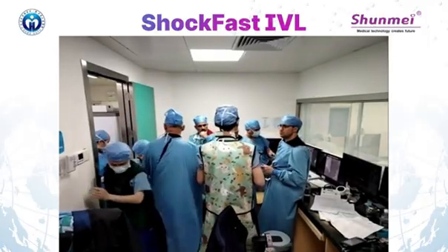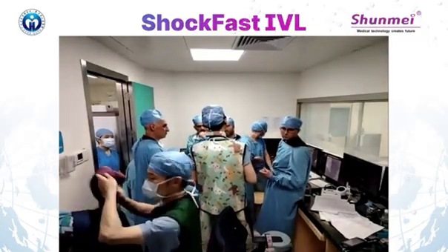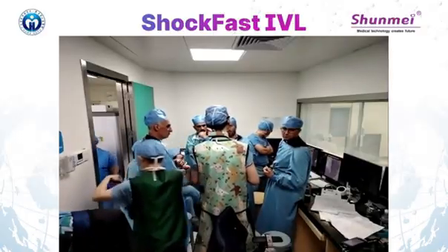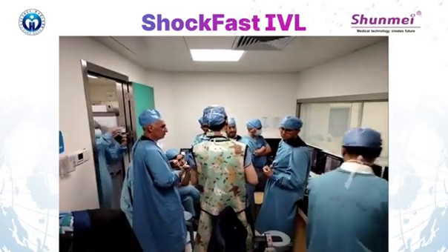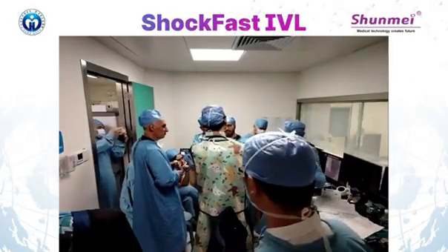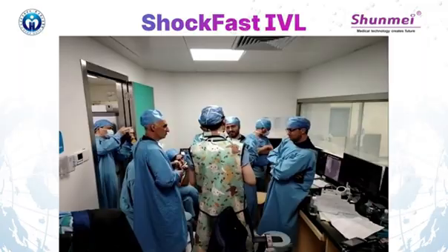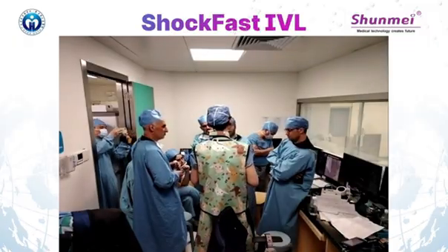Secondly, when we choose the IVL balloon, generally a 1:1 ratio is optimal. But with narrow calcification and tortuous vessels, first delivery is not good with an IVL balloon.